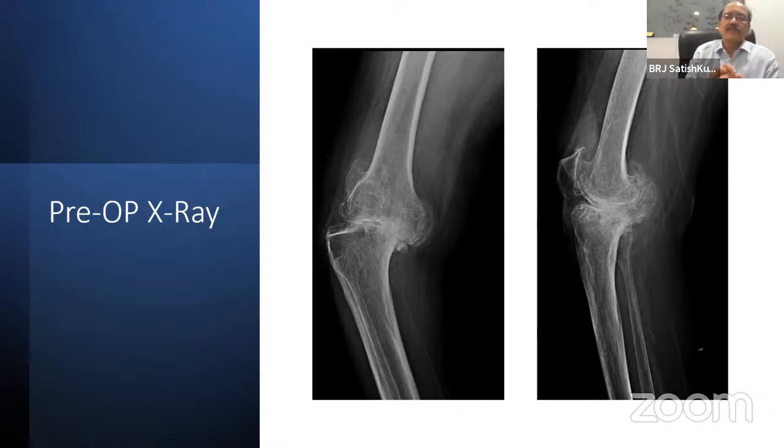That component, I mean the bone piece will come and it will hinder the component. So you have to nibble that, and the fragment becomes relatively thin. You have to use 2 screws. Again, you have to immobilize. Unless it is needed, if this patient requires a good correction, the entire medial tibial condyle has to be skeletonized, anterior to posterior. Then you will get a full correction.